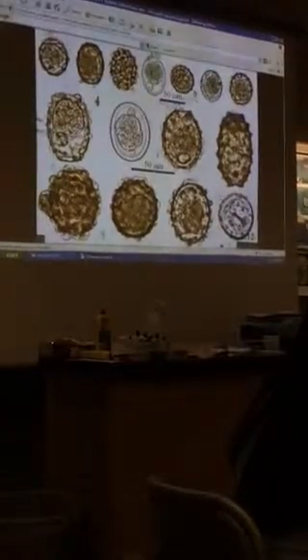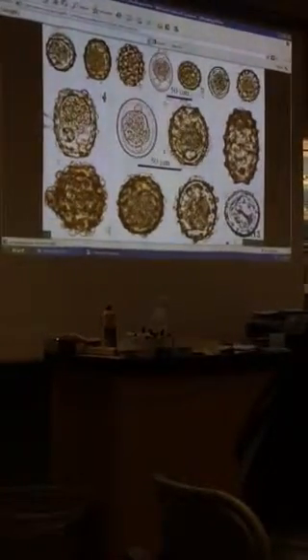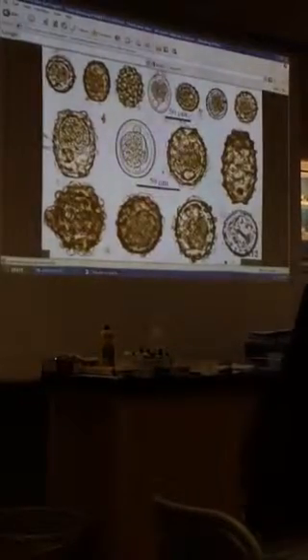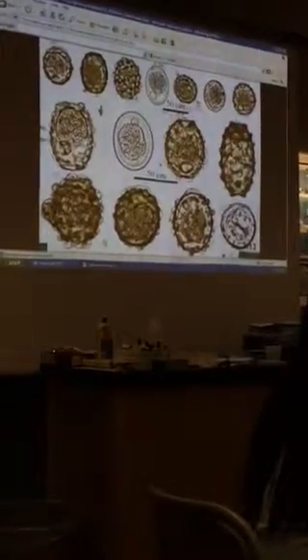Worm eggs. So they're all eggs of Ascaris lumbricoides. Top row is a different magnification, the same magnification as the trematode eggs in chapter 6. They look like this, okay? Like this one here. They could have some variation, be a little more oval shaped, but they've got that bumpy mammillated layer on the outside that makes them easy to recognize.